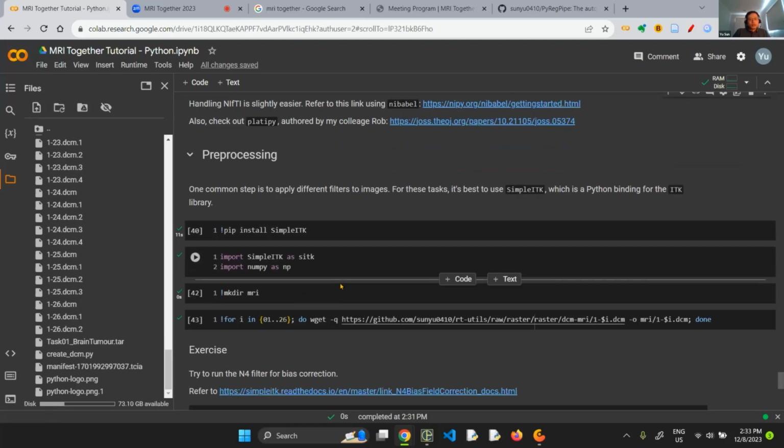There's probably not too much time left, so I'll just briefly talk about this. I think I've basically accomplished my goal, which is to show you a very surgical way to deal with DICOM data. Anything from now on is bonus, extra information.